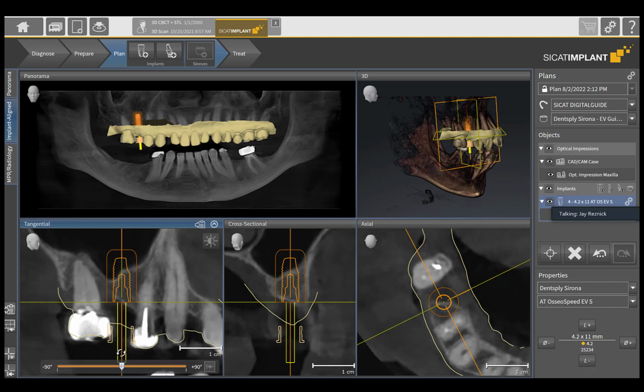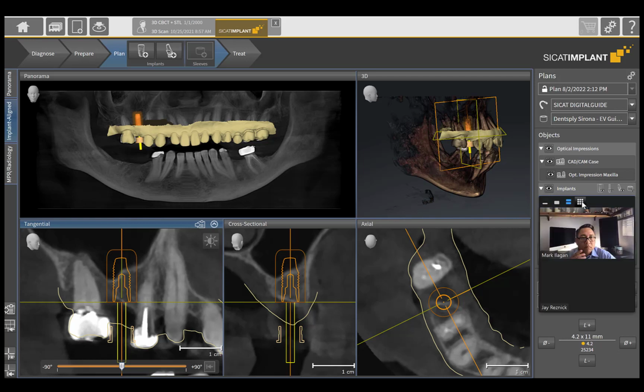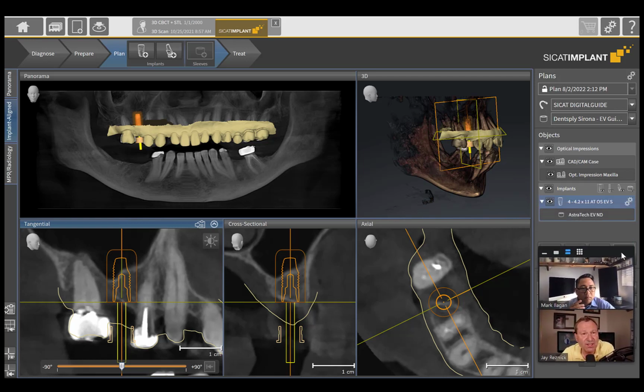Yeah, I do this chairside with the patient, so they are actually watching and they can see. So for example, this patient can see that they're going to need a sinus lift, because I show them, look, even with the shortest implant, the ridge is still fairly narrow. So I think what we need to do is augment the ridge, because the implant doesn't do any good if it's sitting in the air of the sinus. We want to have bone surrounding the implant.